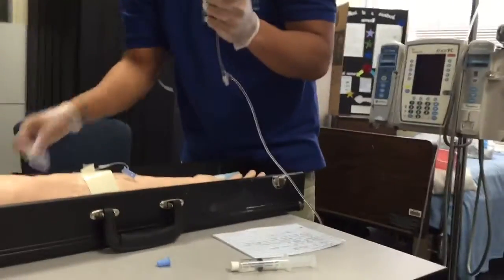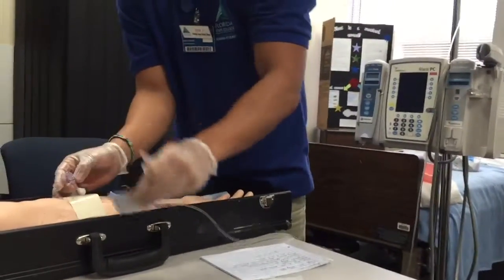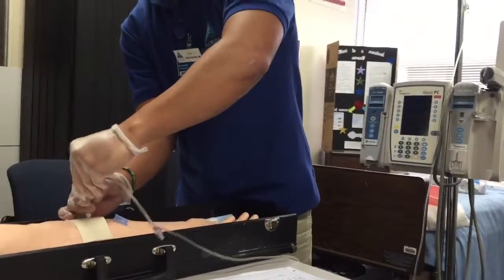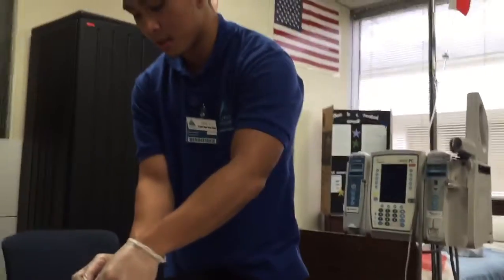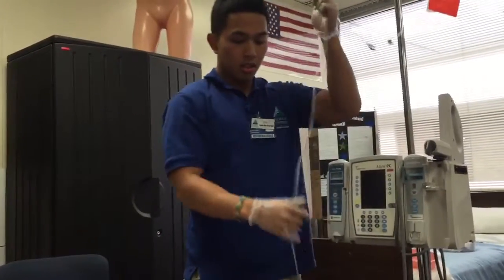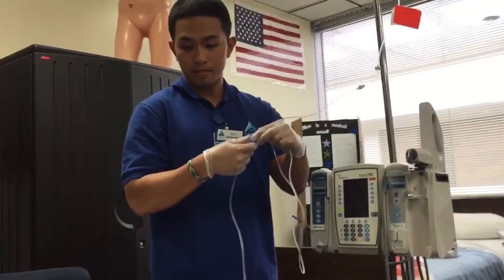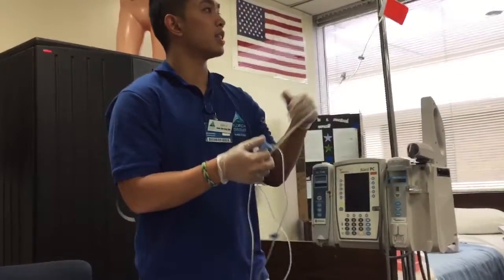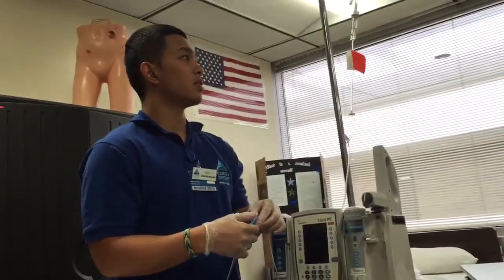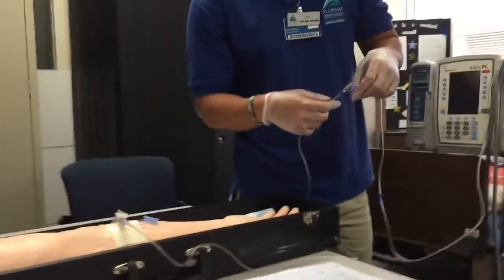I'm going to go ahead and open up another alcohol swab, clean the top of the port one more time. I'm going to go ahead and connect this. I'm going to go ahead and unclamp this one right here. And I'm going to unclamp the roller clamp and watch for it to drip, which it should start dripping soon. Alright, so you do see a little bit of drip. And then you would let this run.